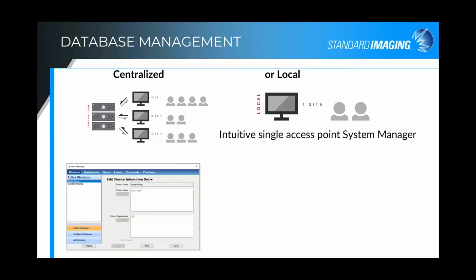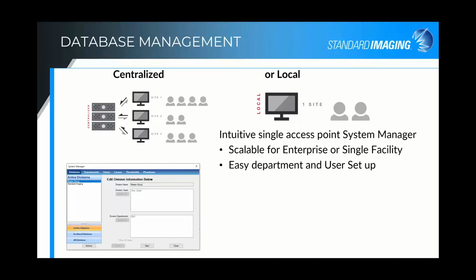But moving on, the nice thing about the software is it's scalable. So if you're just a small center with a single LINAC, or you're a larger group, or you have a number of different centers under one umbrella, it's scalable to that enterprise, or like I said, just a single facility with a single LINAC. It's built to grow with you, if you will.